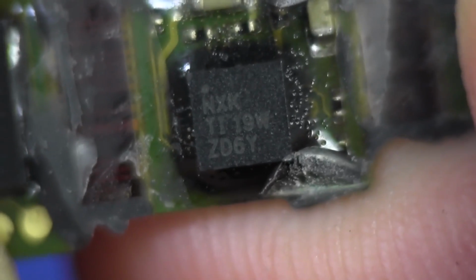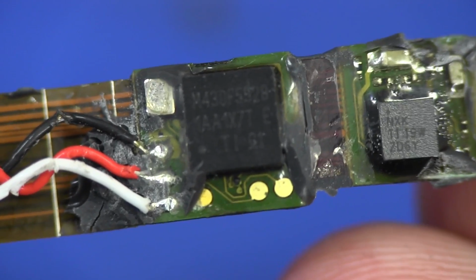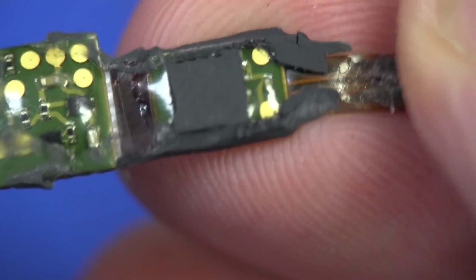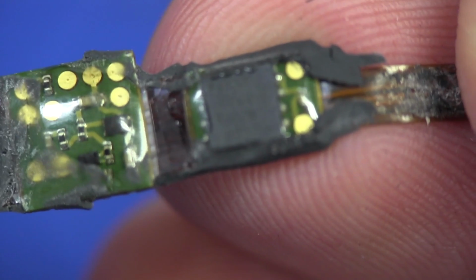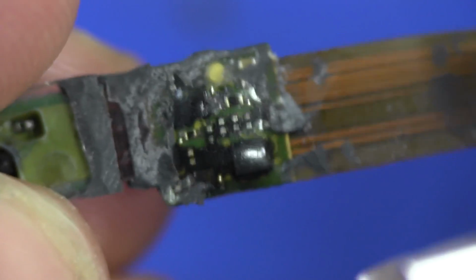That's a USB friendly one, goes up to like 500 milliamps. So it's pretty much all there. We've got our main processor, we've got our lithium-ion battery charger, we've got our serial flash. There's our serial flash for storing all the data. Of course, they don't have room inside the processor. And then we've got our accelerometer circuitry, and interface circuitry over here for our 4-wire interface, and that's about all she wrote, really.